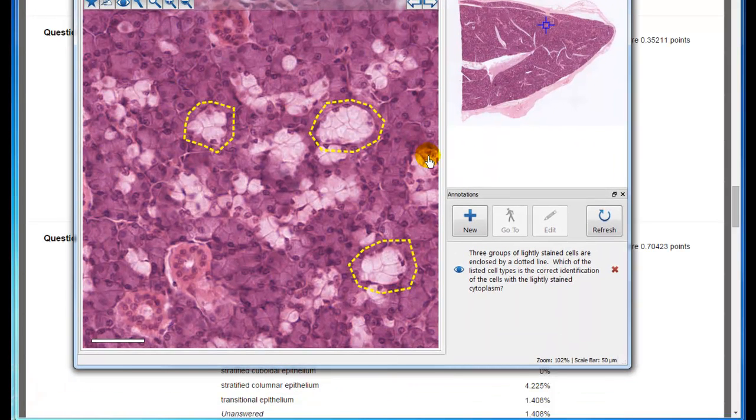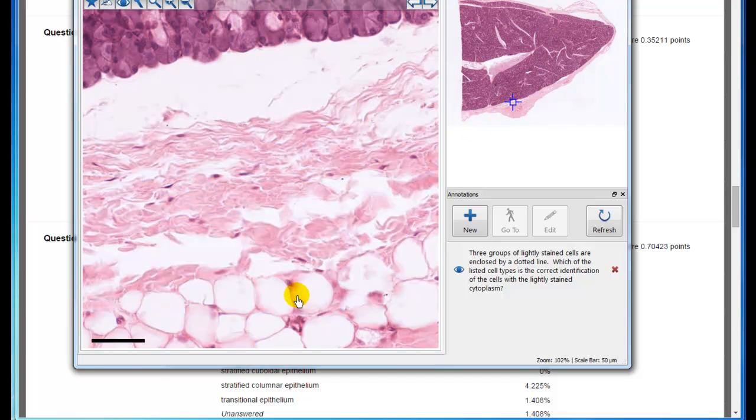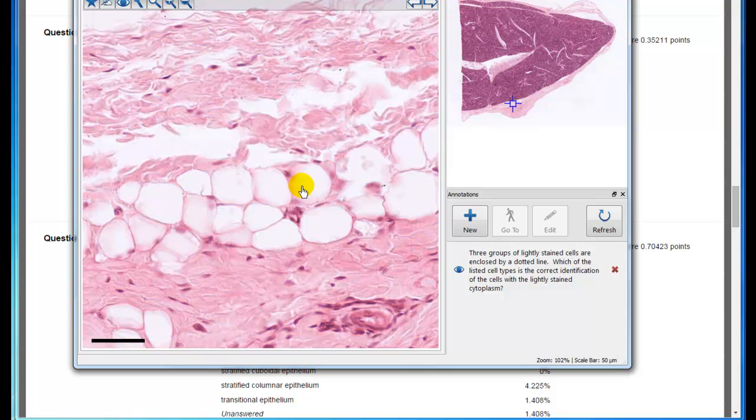Well, here they are. Now, if these were multilocular, you would see a lot of little tiny round lipid droplets in here. And if they were indeed fat cells, maybe I could find a fat cell. See, fat cells look like this: very clear, usually pretty large, with the nucleus right at the edge, very flat, like here, and maybe here.